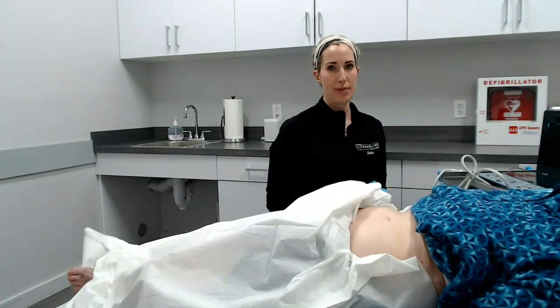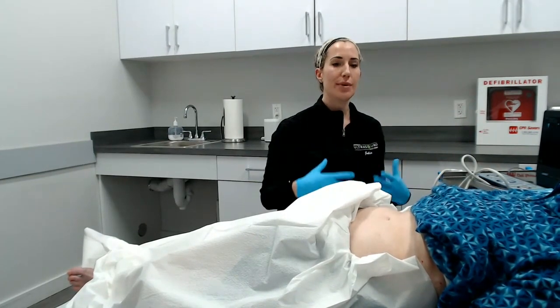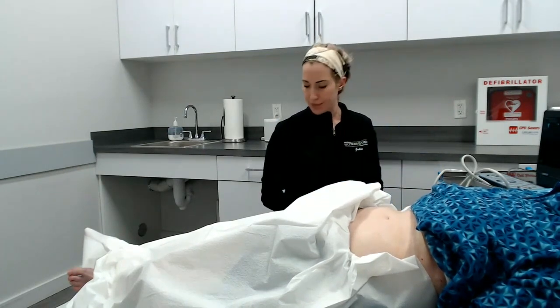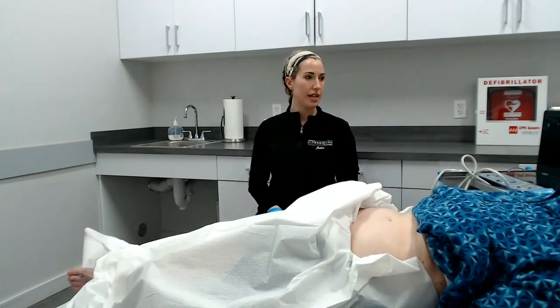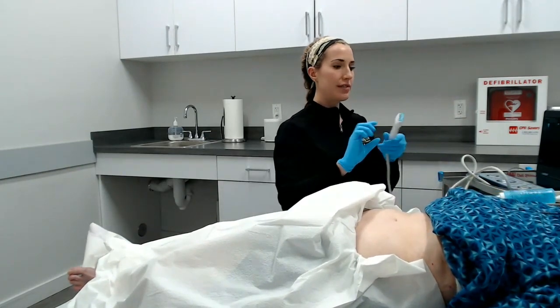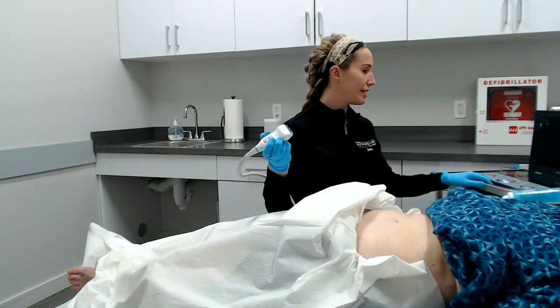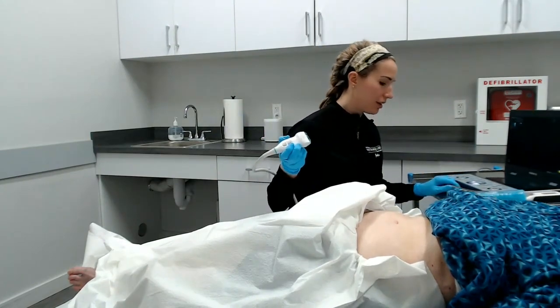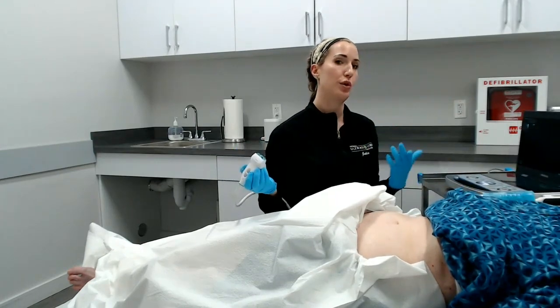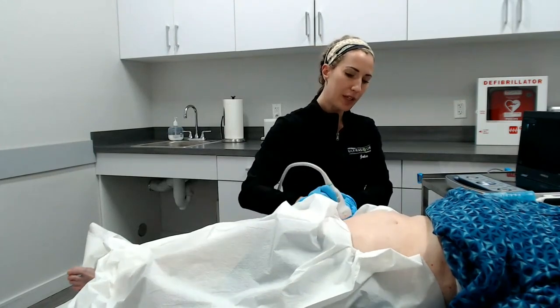Minimal movement. I always tell my patients, you can't really talk as much when I'm looking at your groin area because any movement or talking, breathing, respiration can influence venous flow. So I'm just going to lay her flat a little bit. Okay, a little pillow behind her head is fine. Again, I'm going to look at her common femoral vein on her right side, and then I'm going to look at her left common femoral vein, and then we're going to go to her left leg and show you her DVT and what it looks like now.